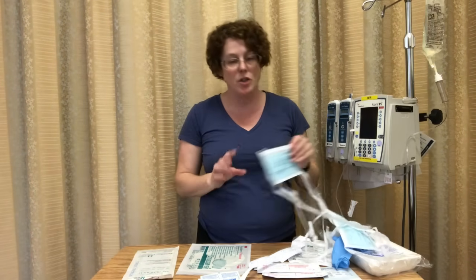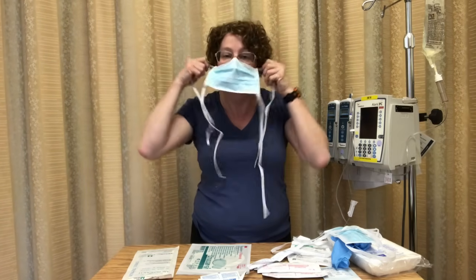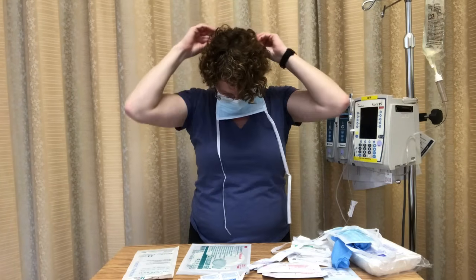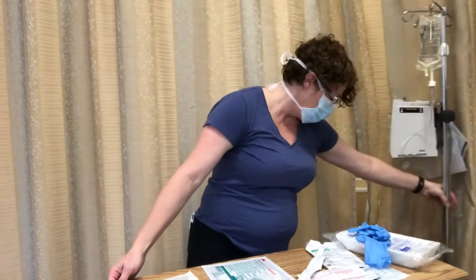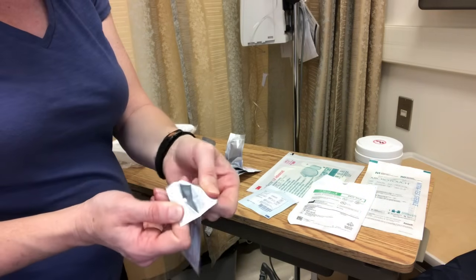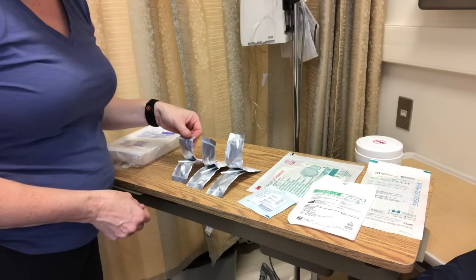Before we get started, after hand hygiene and patient conversation and explanation, we're going to put on our mask, and then the mask for our patient as well. Now I'm going to get my tray set up so that it's within arm's reach. I'm opening my chlorhexidine swabs — they have a nice fold so you can pull it down without touching it to keep it sterile. I'm going to be using those first.